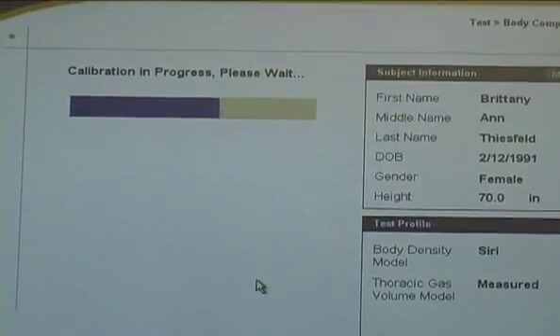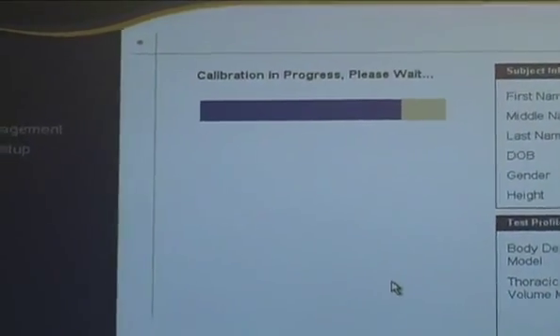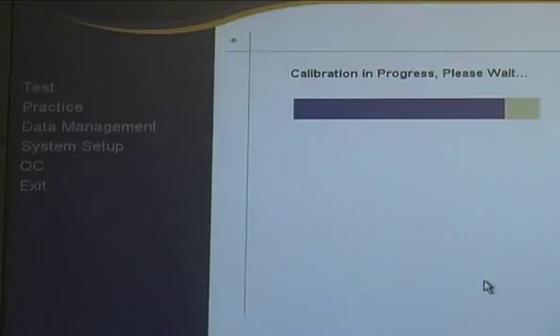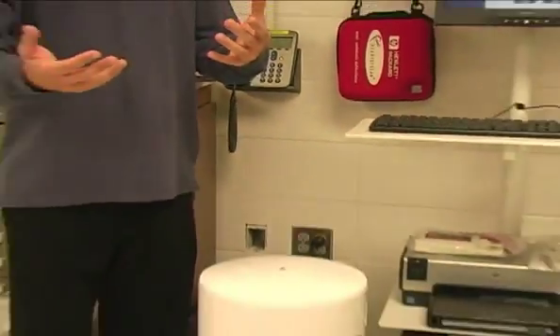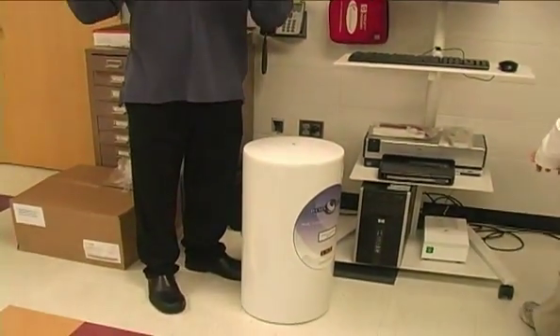Then it's going to prompt Stacy to put in the known volume. And if you drop this volume, then you're going to affect the calibration. So she'll put this in, and then after that we'll have Brittany step on the scale. That's the mass portion, and then from there we'll introduce her into the BOD pod.